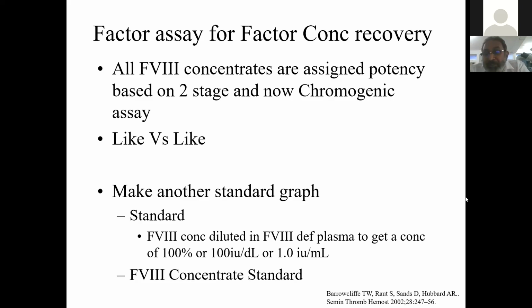That means whatever chromogenic assay results you get, the same results you will get with the one-stage factor assay. So that's why there is something called a factor VIII concentrate standard also available from NIBSC. You can use that standard to create the standard graph, and of course you can use a one-stage factor assay.